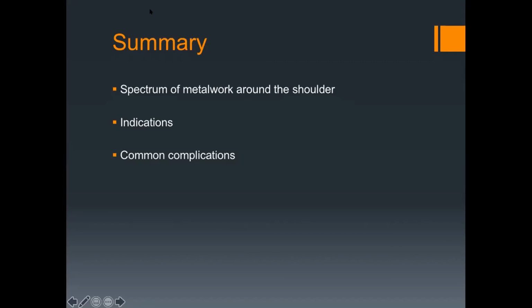The one thing we maybe just skipped over a tiny bit was that shoulder arthroplasty is divided into your fracture ones and your non-fracture ones, and they have their different problems. If you have a fracture, say hemiarthroplasty, what's really relevant is that the tuberosity often lyses. So what a radiologist may see is that they seem to have put bone around in the tuberosity region, and now the head's gone up and I can see no bone there. That's either they've pulled off or they lyse.